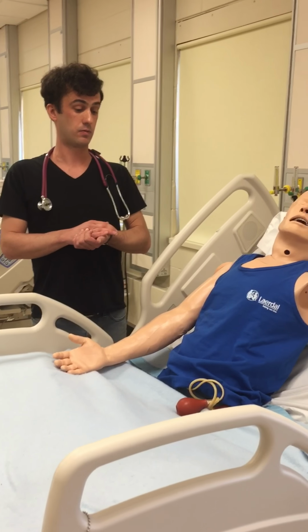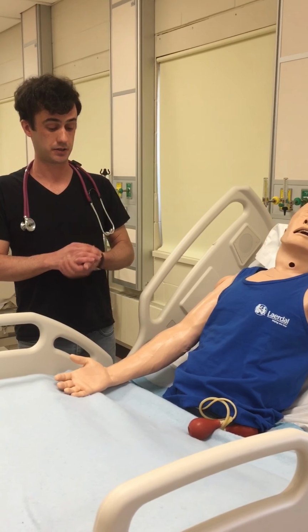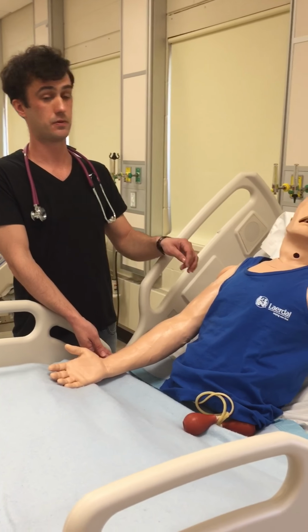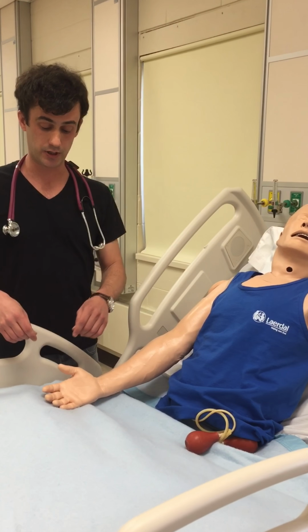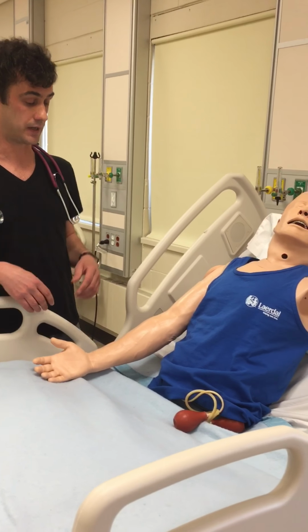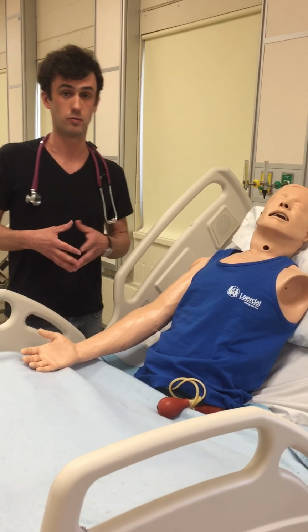At this point, I will evaluate the patient's vital signs. I will count his pulse rate for a full minute, his respiratory rate for a full minute, and I will check his oxygen saturation using a pulse oximeter. I need to make sure that the vital signs are within normal values.